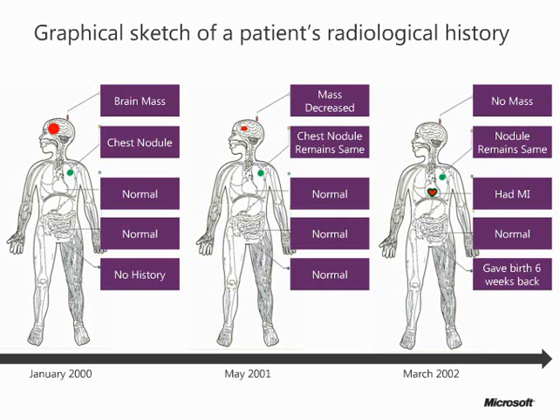And now the patient has developed cardiac pathology, an acute MI. I would suggest that in a matter of 2 or 3 seconds, just looking at those 3 pictures, I can gather an incredible amount of information about the patient. And this is the type of display that I really want to have this automated system be able to create for me in my next generation PACS system.